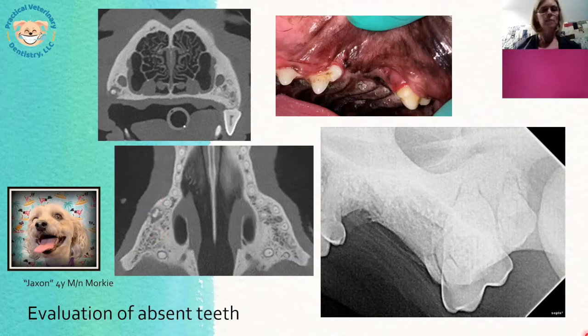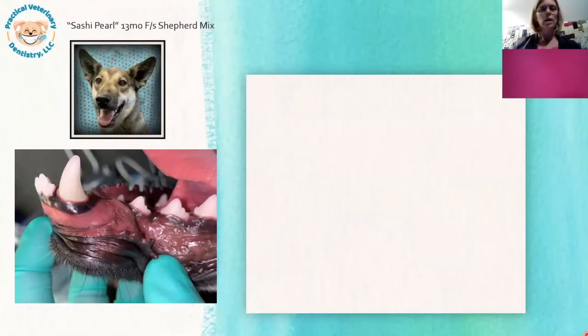There is definitely pathology around it that is just absolutely not obvious on the radiographs and not obvious on the visual exam as well. So this is something that we could address having had this. So we use it, as I said, on every single patient, whether we're expecting real problems or not. And some of them are a little bit more severe.